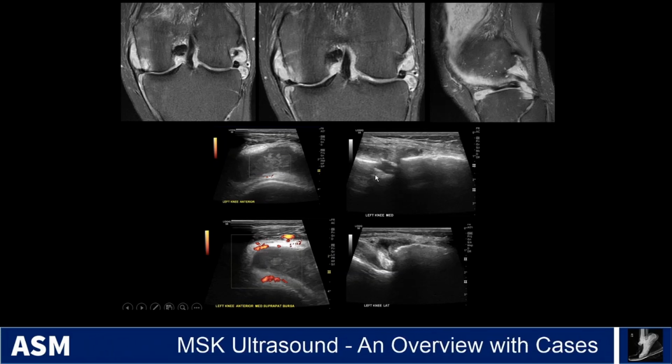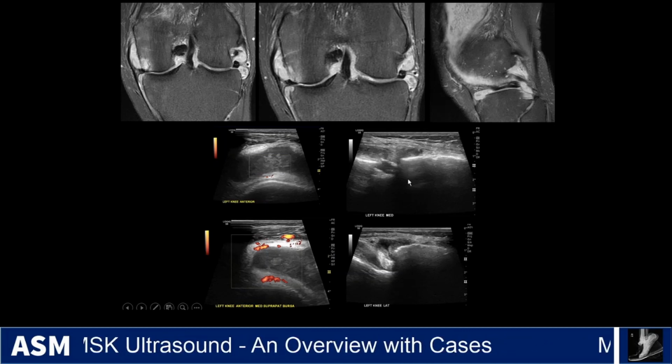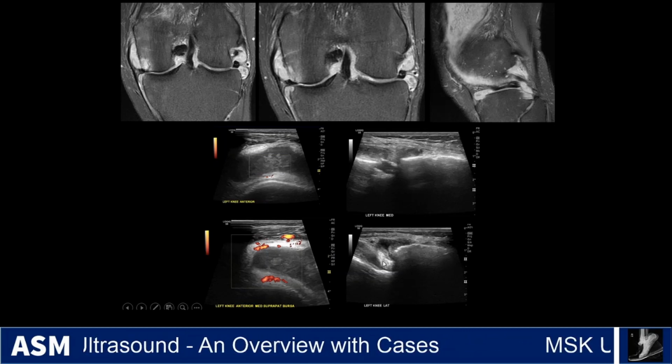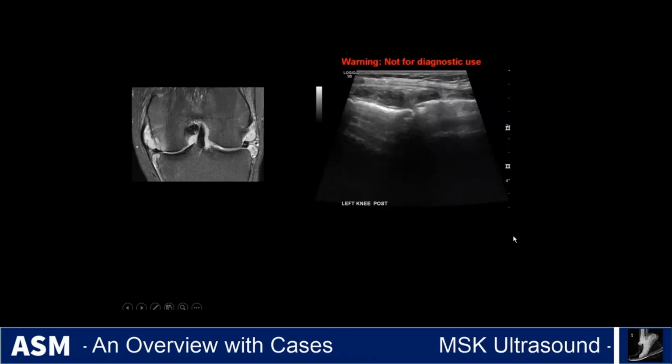You see this frond-like material within the bursa, thickening of the wall, and marked hyperemia here. And then you come to the side here, and you can actually see these erosions in the bone with this synovial proliferation here. So this is the popliteus tendon here on the lateral side. So this is a good case of rheumatoid arthritis of the knee.